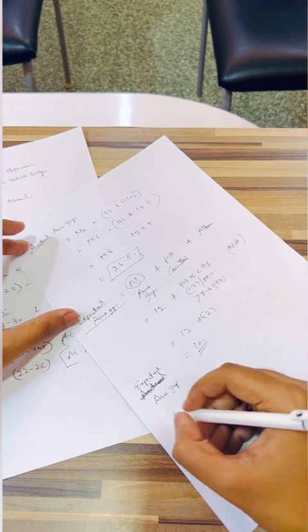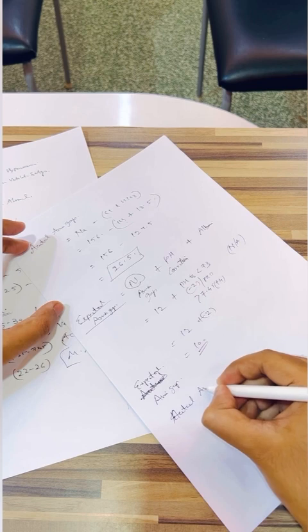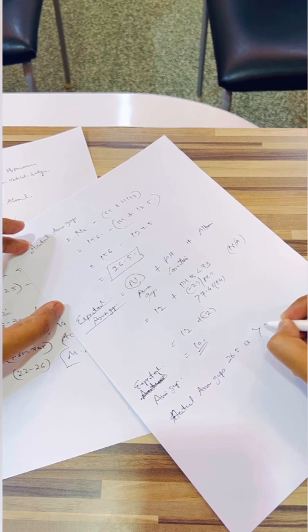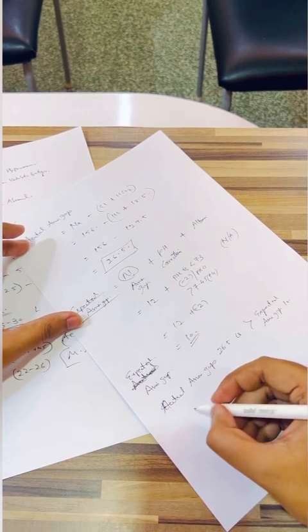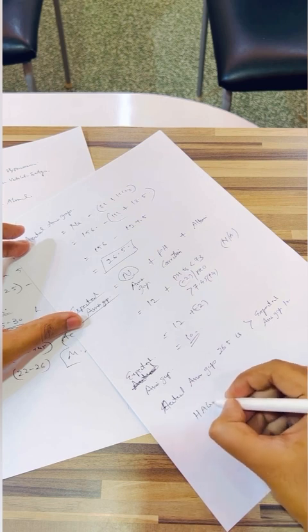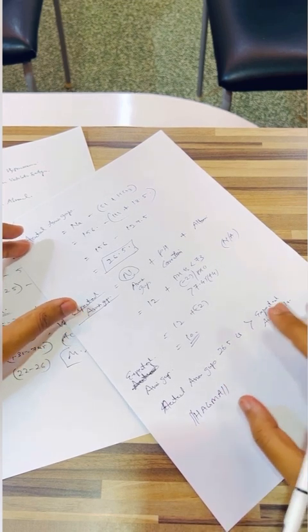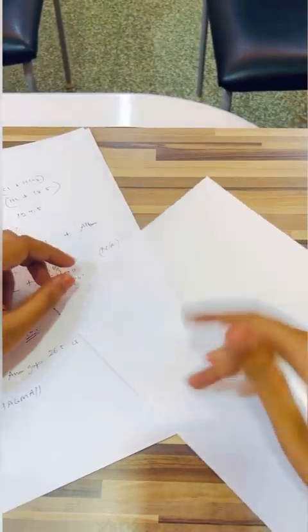Coming to the conclusion, the actual anion gap 26.5 is more than the expected anion gap, which is 10. So finally we can come to a conclusion that it is AGMA, high anion gap metabolic acidosis. So now we have come to a conclusion that this is an AGMA. And the final thing, we have to talk about the bicarb, so that we should not forget.